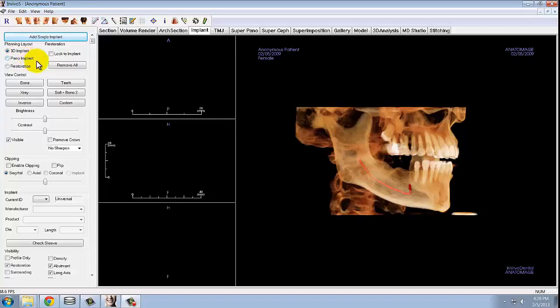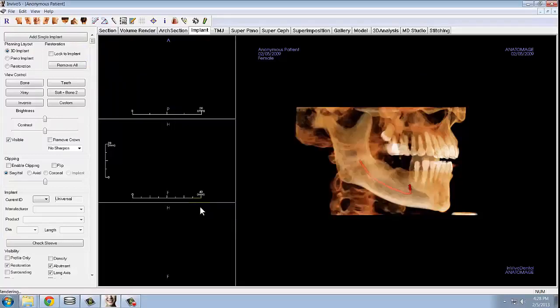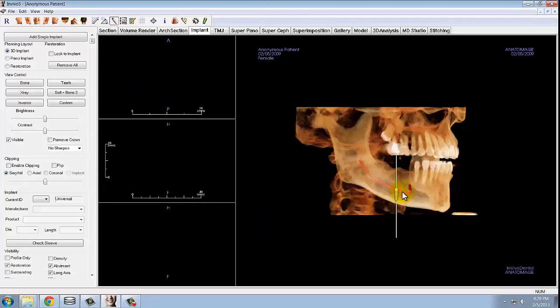Once you have rotated the volumes so you can see the implant site, you can go to the control panel and select Add Single Implant. Now you can select the correct tooth number for the implant and click OK. Once you click OK, the implant will now be following your cursor and you can click on the volume to place the implant.